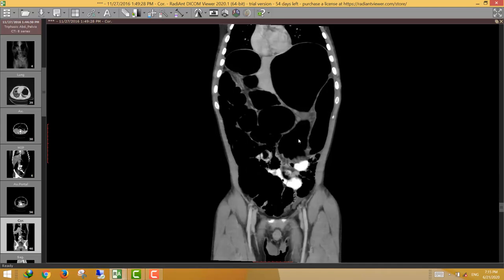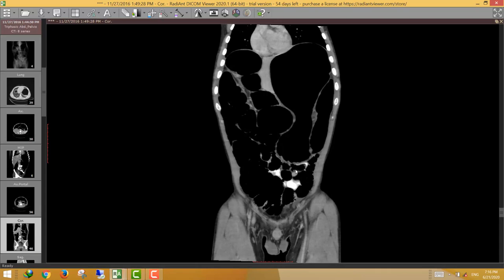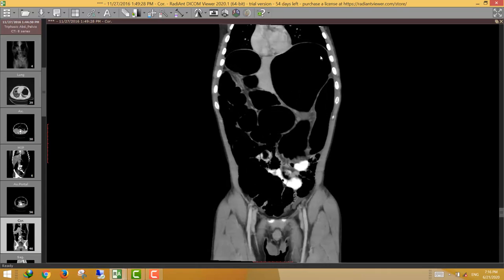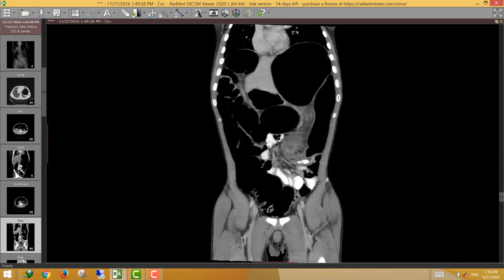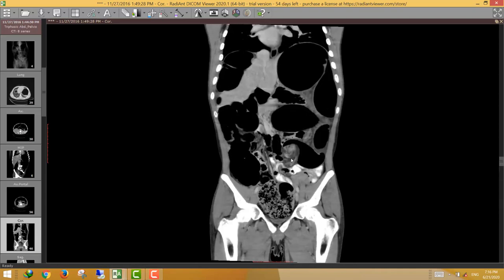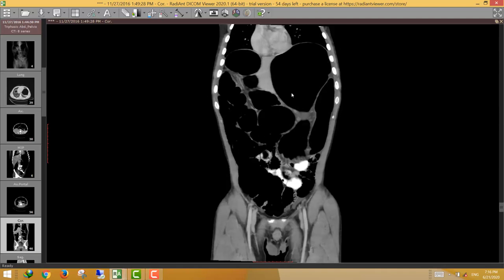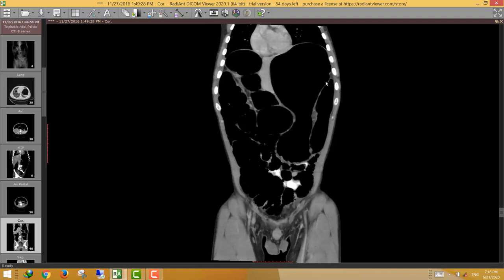The second important thing is that volvulus causes a closed-loop bowel obstruction. It obstructs the bowel at two points. Here the sigmoid colon is obstructed at this point and at this point — two points of obstruction. The dilated sigmoid colon forms the characteristic inverted U-shape extending into the left hypochondrial region, very characteristic of the closed-loop pattern of obstruction.